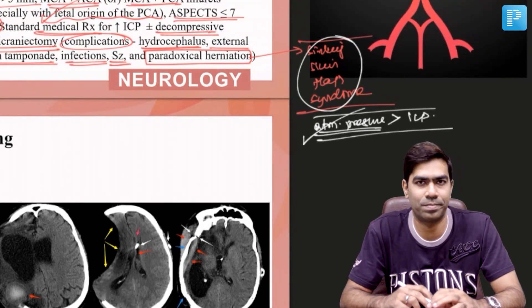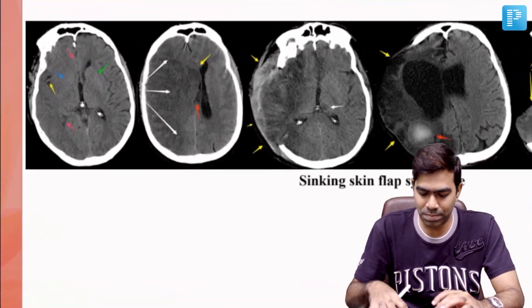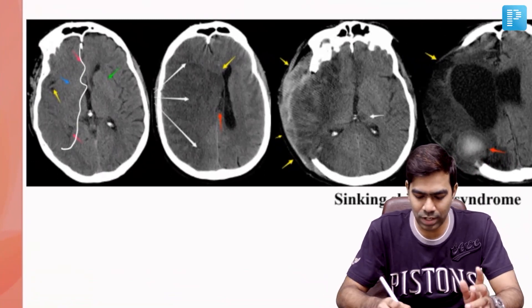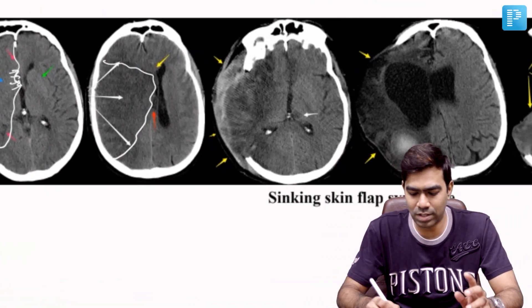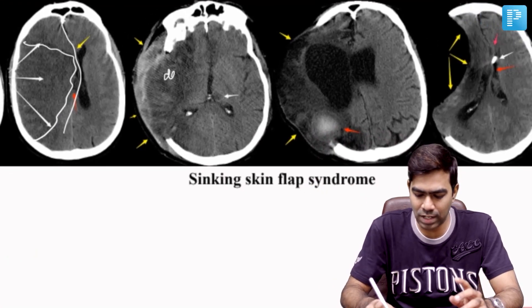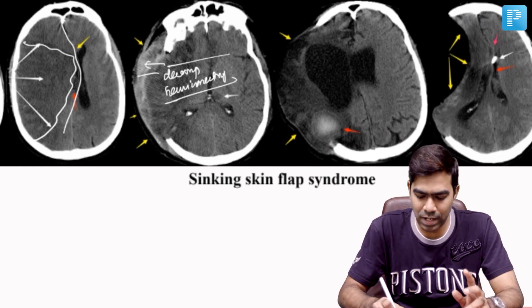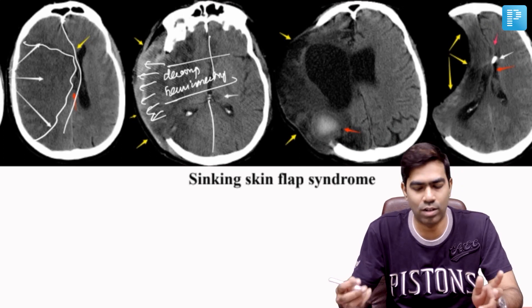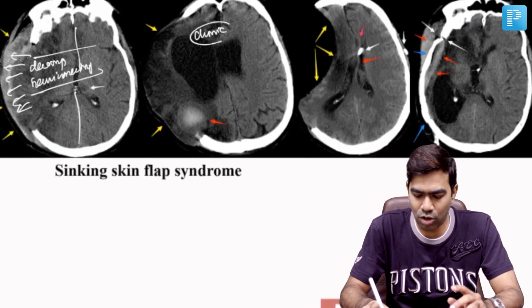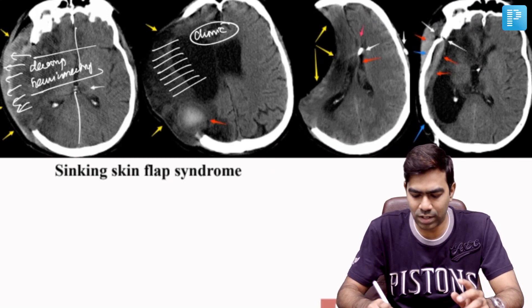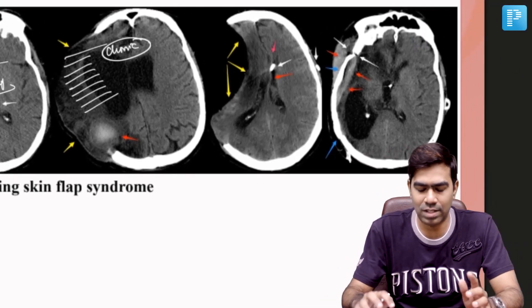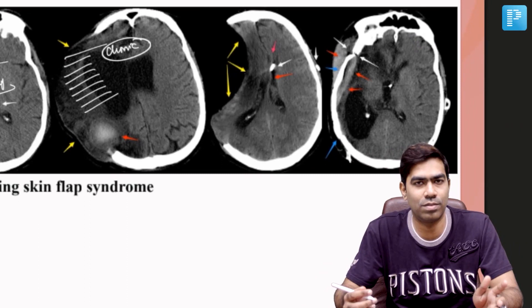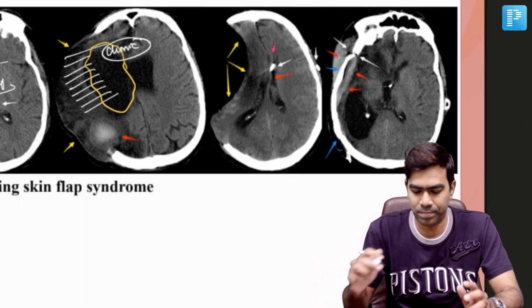This is a case example of sinking skin flap syndrome. Early CTs show a huge stroke with mass effect on the ipsilateral ventricle. Later CTs show very obvious hypodensity with a huge midline shift. The patient underwent decompressive hemicraniectomy, after which brain tissue expands outward and midline shift is corrected. In the chronic stage, the infarcted tissue has been destroyed and replaced with CSF-density fluid — referred to as cystic encephalomalacia — with ipsilateral ventricular expansion.